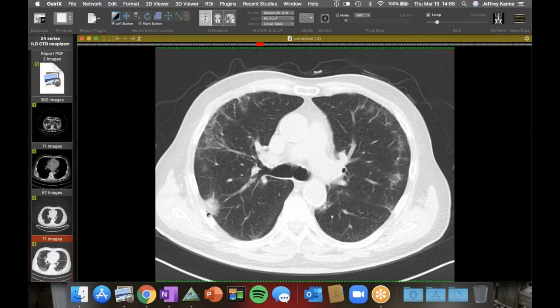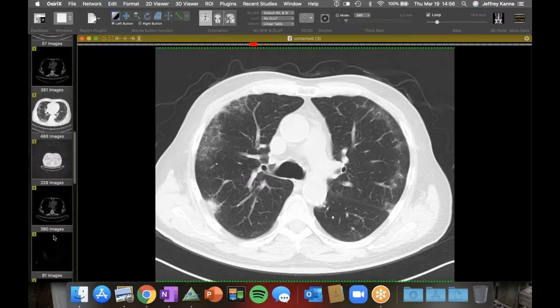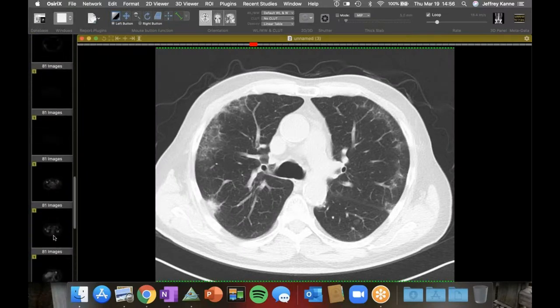This is pretty round. And with respect to the fat tethering, the extrapleural fat, I don't find that particularly helpful always, because sometimes you see that with fibrosis and even with chronic inflammation, you'll get hypertrophy of the extrapleural fat, and you'll see tethering along the fissures. But it's a nice example of a case. I don't know if there's a coronal in here. I'm not seeing one, but yeah.